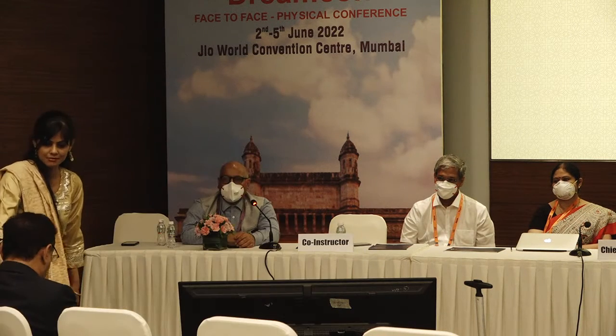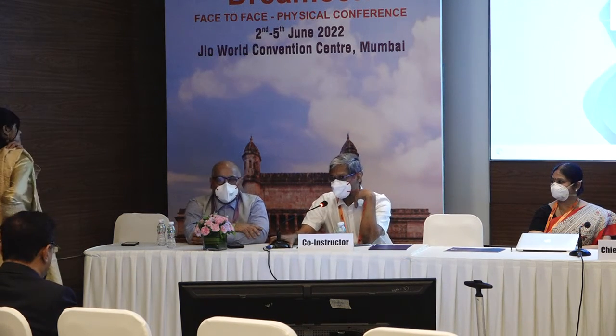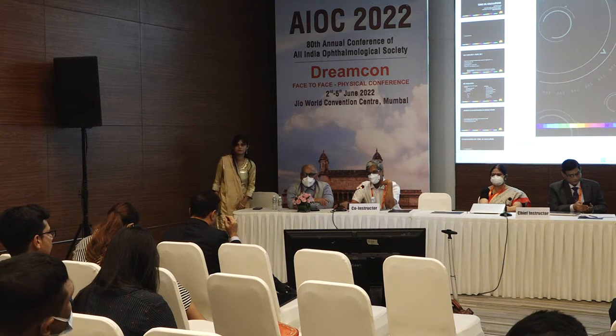I have one question. You had said that post-RK, corneal thickness is not altered, so you prefer a Scheimpflug or an OCT-based system. So Placido is not on, no? I mean, you can use any one, right? You can even use a Pentacam. Yes, you can. You just need a measurement of a very small central zone, like 2 millimeters or so. But the flattening area that happens in RK can be from 2 millimeters to 3 millimeters to 4 millimeters. But you are worried about the central 3 millimeters.